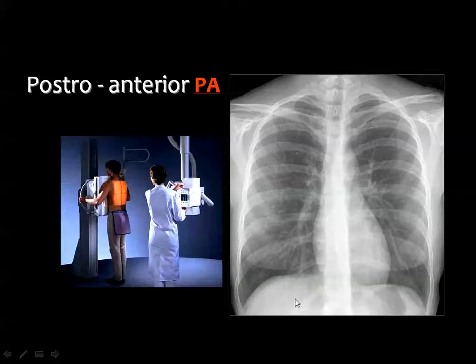Then we should go first for some radiographic terminologies, and you all know, especially the radiologists, that the most popular chest x-ray at all is known as the PA view. And the PA view is the postero-anterior view, and most of the radiologists know that the x-ray is named according to the entrance of the x-ray beam through the human body.